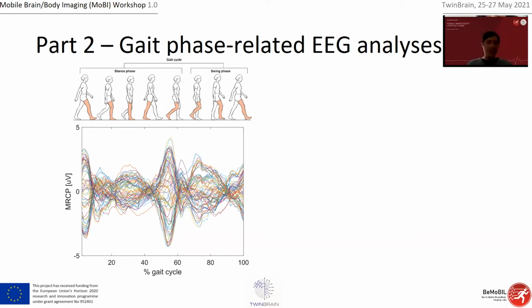And because we did not yet do a special consideration of artifacts, and these MRCPs just contain the raw recordings, no frequency analysis, nothing like it, I think we should be most suspicious that those two huge fluctuations at around 0 and 50% might not be physiological.